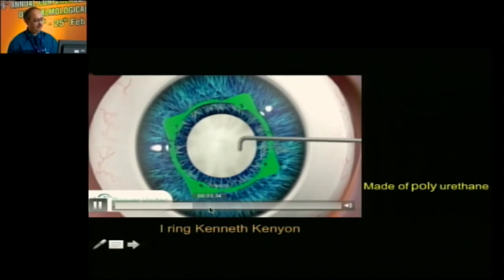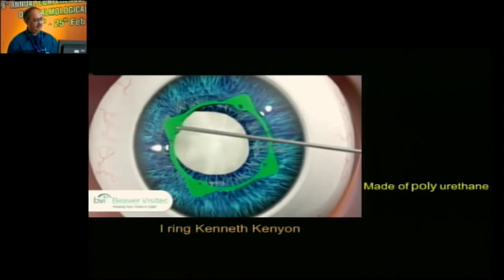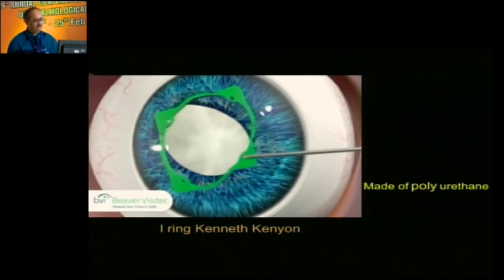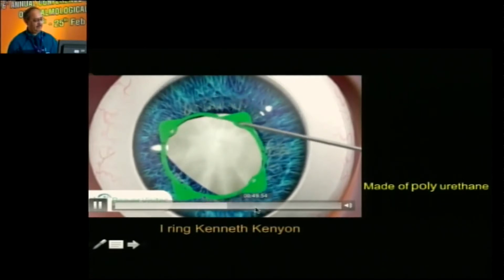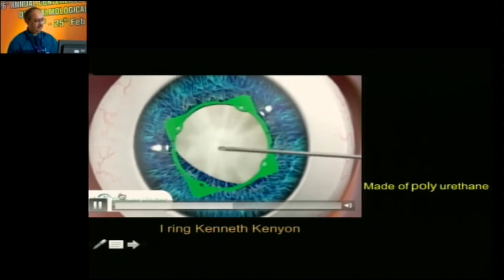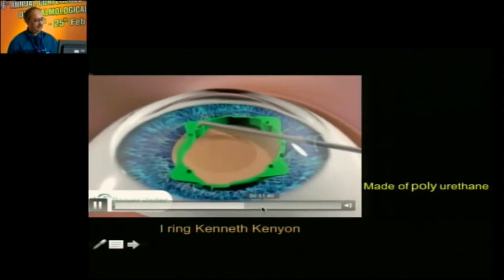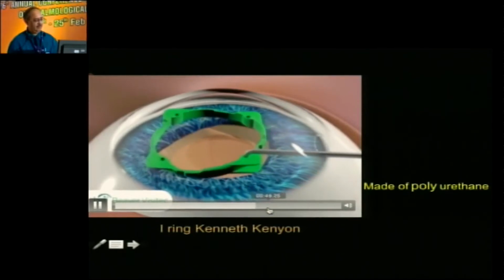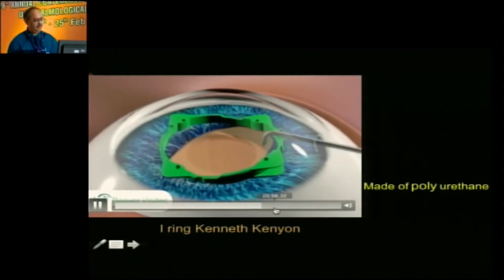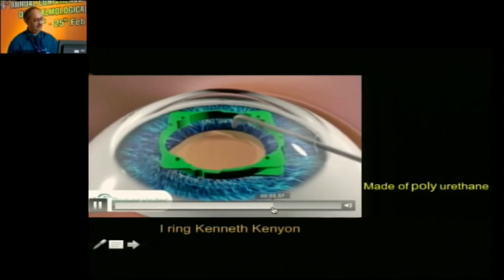Next, engage the 4 channels of the ring using a Sinskey hook. Secure the distal channel to the iris first, then the proximal channel, followed by the 2 lateral channels. Position the channels using a Sinskey hook. Always begin with the distal channel, followed by the proximal channel, and finally the 2 lateral channels.